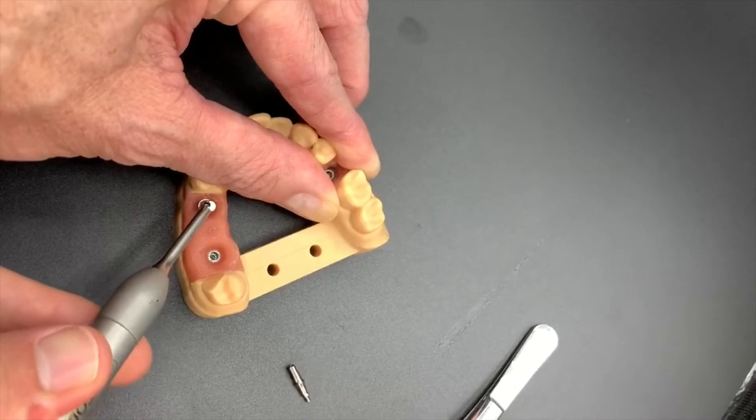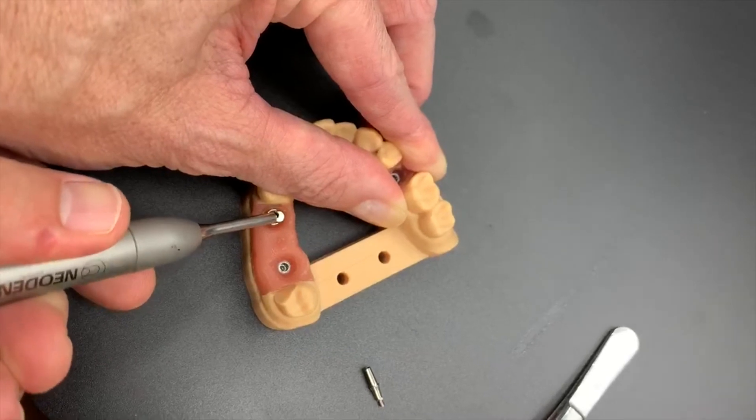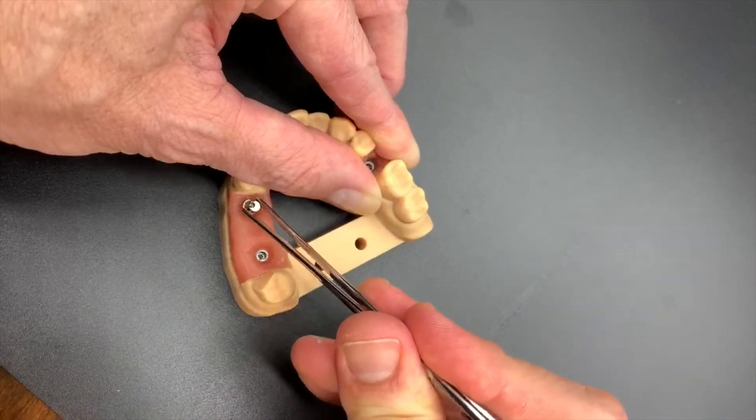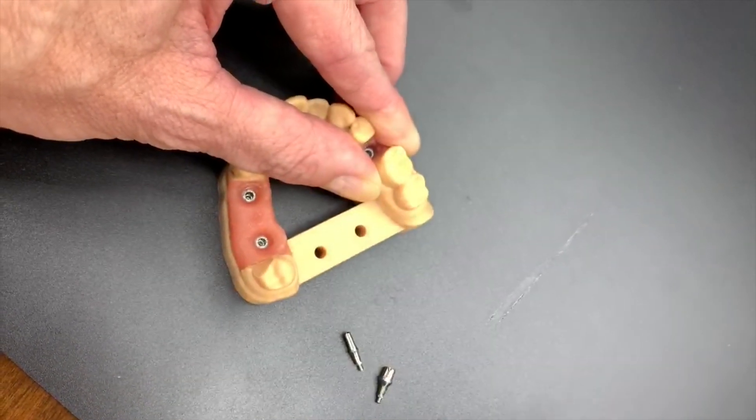Tap, tap, tap — so that it releases the seal between the abutment and the implant. And as long as our screw is backed up completely, it's obviously much easier to remove the abutment.